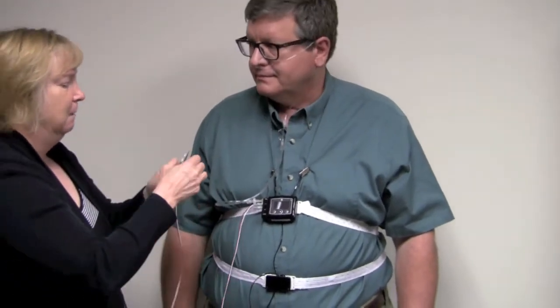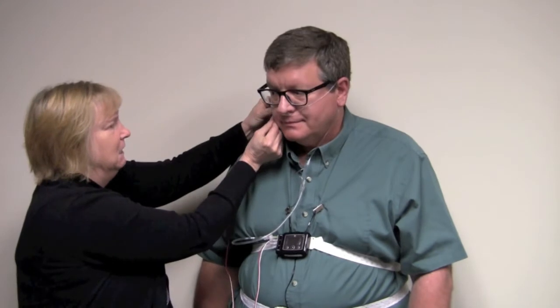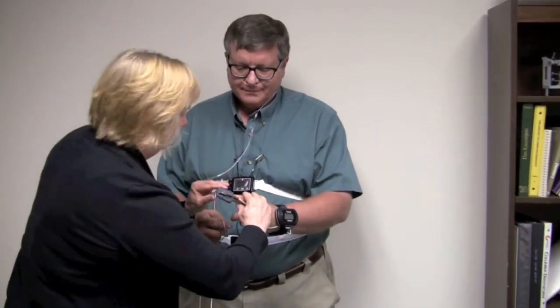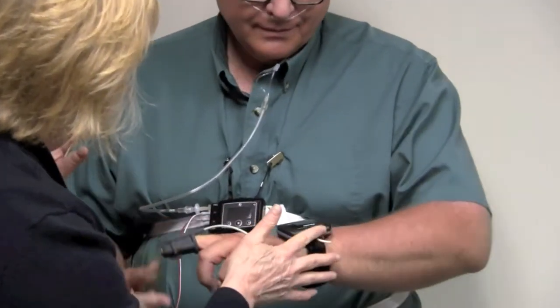The last step is the bruxism lead so we can determine if you're bruxing at night and how hard. We're going to place this on your masseter muscle, right here on the side of your cheek. Open and close and feel which muscle is moving — that's the muscle we're putting this on. Tonight when you're ready, peel the tape back and place it on the masseter muscle; it's easier with the cords going toward the back, and you may want to wrap them up inside your shirt. The final piece is the pulse oximeter — it's a lot like wearing a watch. Slide it on, put the finger probe on your finger and push it all the way to the end. You can see it's starting to work.